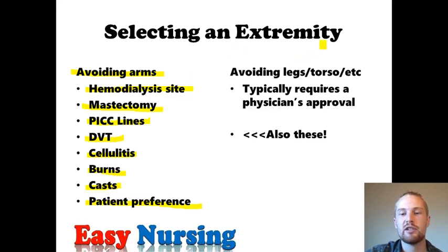Now, what about legs and torso and the neck? Well, typically, at least where I work, you'll need a physician's approval before you're able to utilize those sites. Plus, you also have to deal with all these issues here as well. So typically, always go for the arms first.